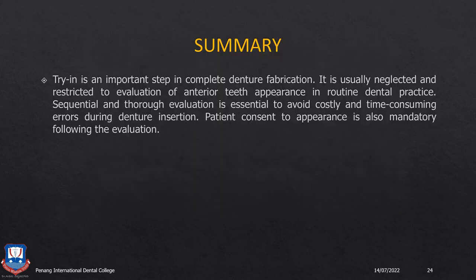So this more or less brings us to the end of this lecture. Try-in is an important step in CD fabrication. Many times we neglect it, because as soon as we put the dentures in the mouth and the patient is happy, we think our work is done, and we just tell him to bite, and we see okay, occlusion seems fine. The key of occlusion, we check the first molars, and that's it.